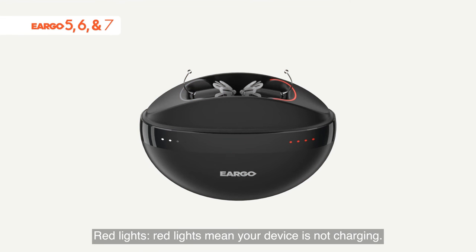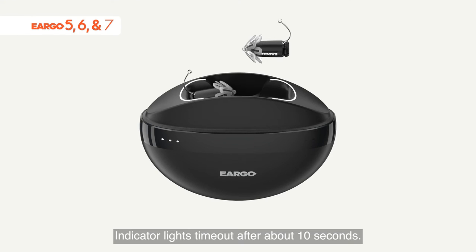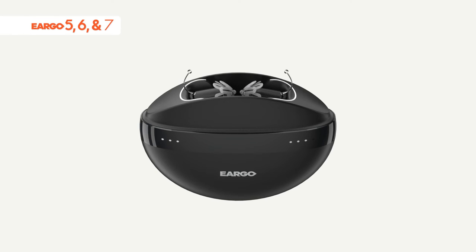Red lights mean your device is not charging. Remove your Eargo device from the charger to clear the red lights. Indicator lights time out after about 10 seconds.